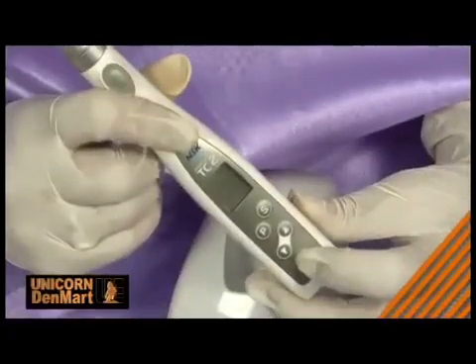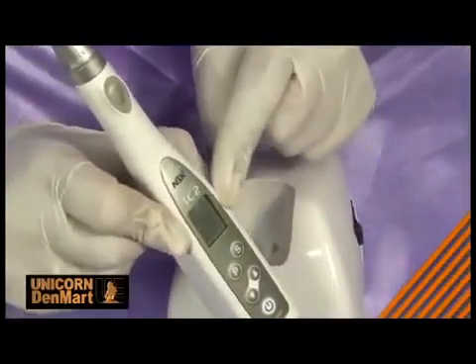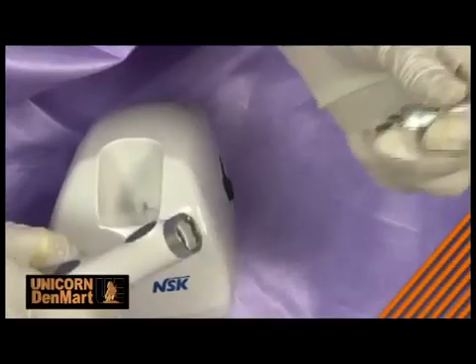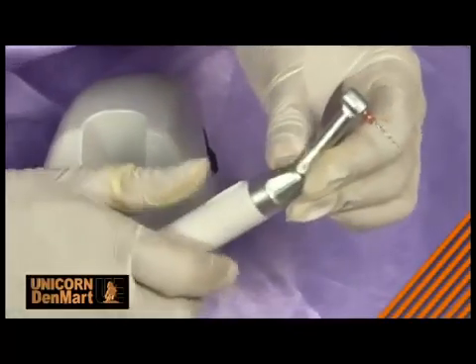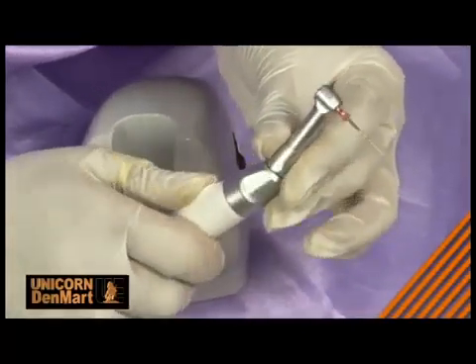The autoreverse function can be programmed to stop following autoreverse activation. The handpiece also comes with many advantages. Its quick release system allows head exchange easily, and its compactness and flexibility allow excellent reach and visibility to the treatment spot.